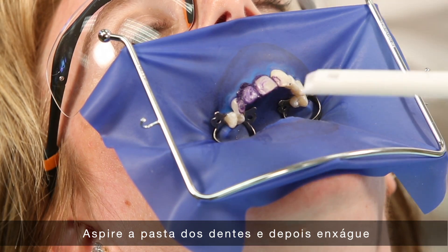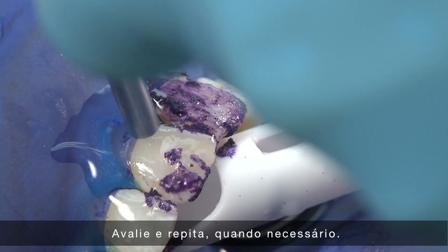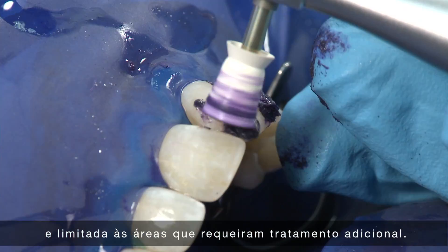Suction the paste from the teeth first, then rinse. Evaluate and repeat as necessary. Re-application can be conservative and limited to the areas requiring additional treatment.